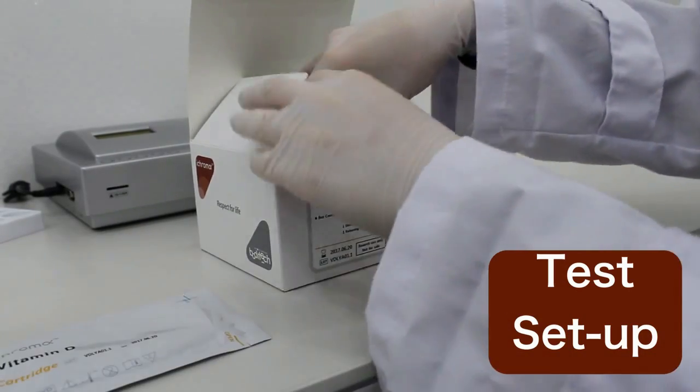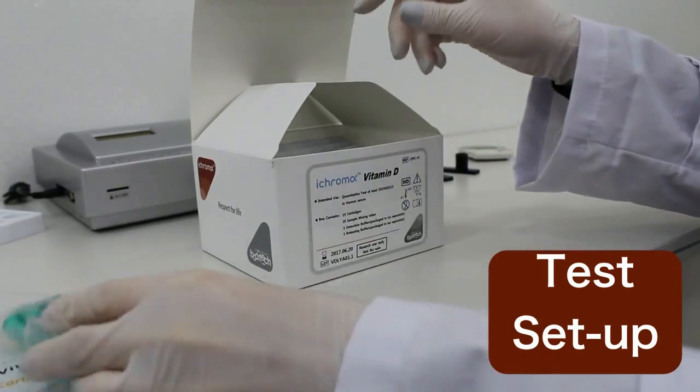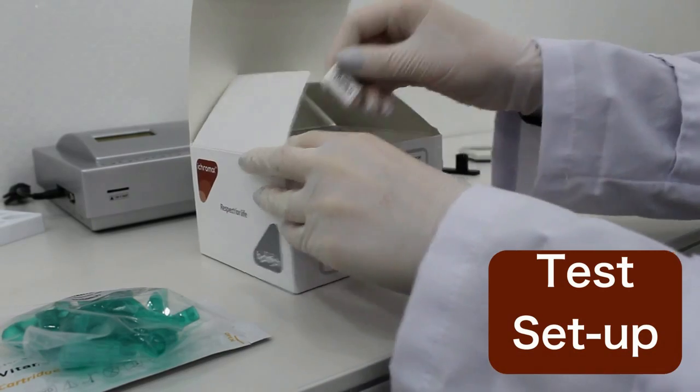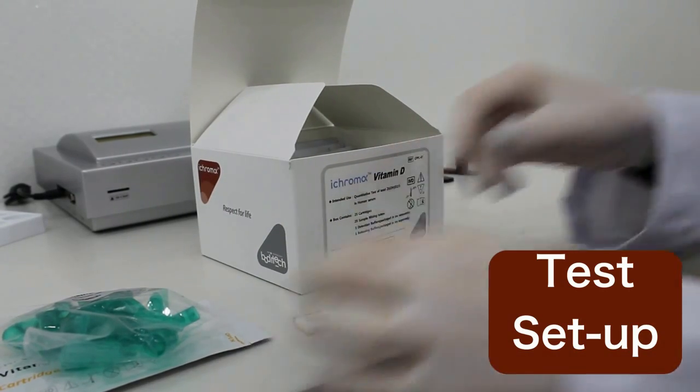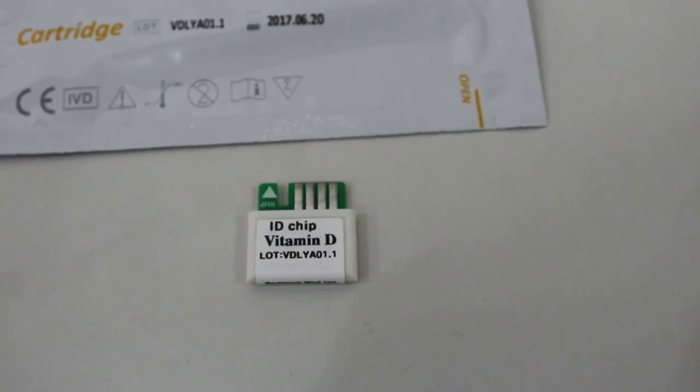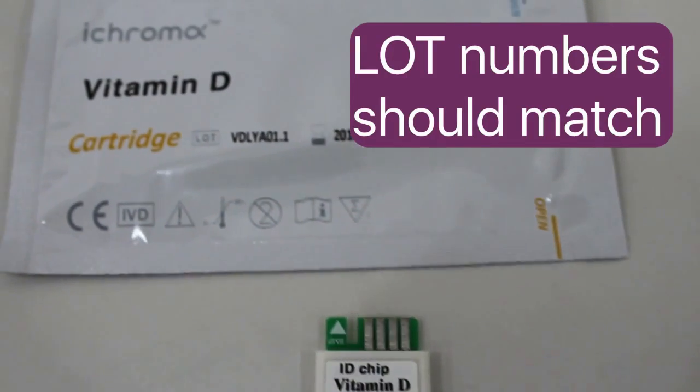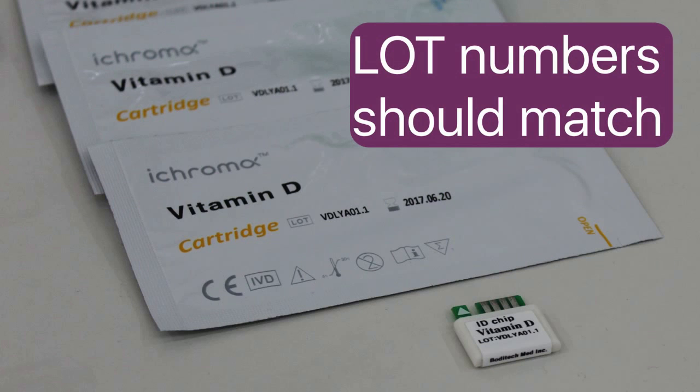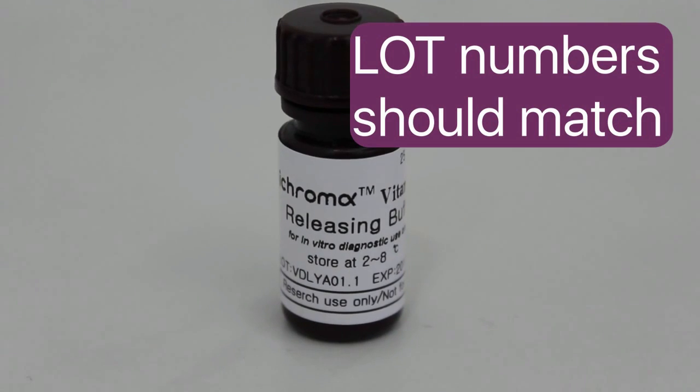The vitamin D kit should have the sealed test cartridge, mixing tubes, ID chip, releasing and detection buffers. Also make sure that the lot number of the test cartridge matches with that of the ID chip as well as the releasing and detection buffers.